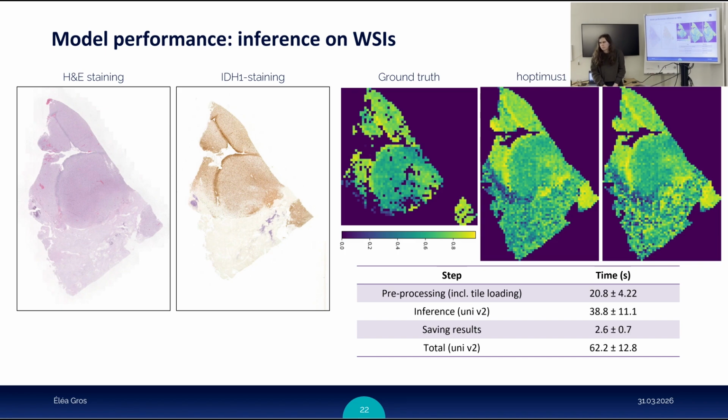And if you think, I mean, you have to ask yourself, what is the aim? GLIOMETER can serve multiple aims, right? And if one of those is, like Éléa said, to assess the tumor cell content, for example, in order to perform molecular analysis, and in order to have such a successful analysis for the final classification of the tumor, then the technicians usually do biopsy punches, small biopsies of the paraffin block, and usually it's around, I don't know, 0.3 centimeter in the diameter.